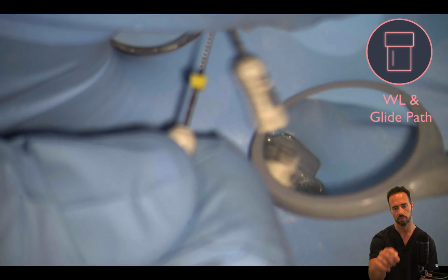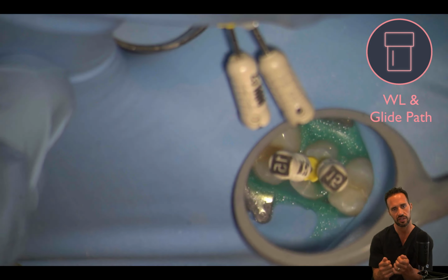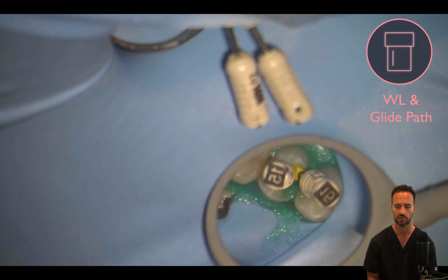Okay, and you can appreciate the little bends on those hand files. Like I said, every hand file that gets introduced into the tooth has a slight curvature to it. You just lean against your mirror and create that nice soft curve. Nothing sharp, just a nice soft curve.